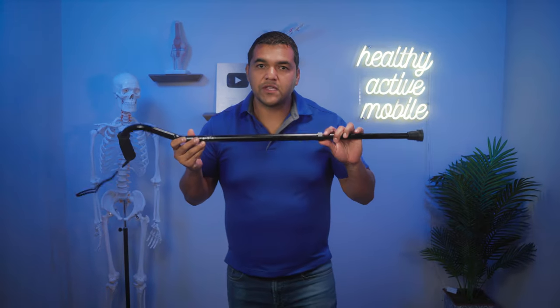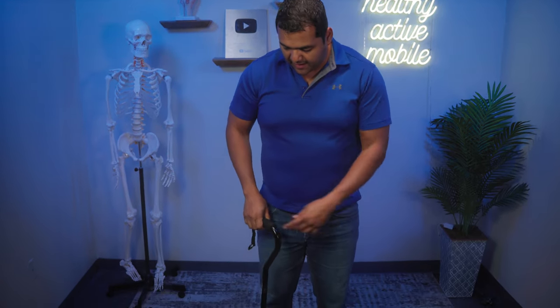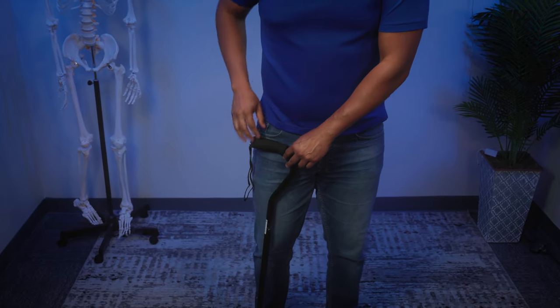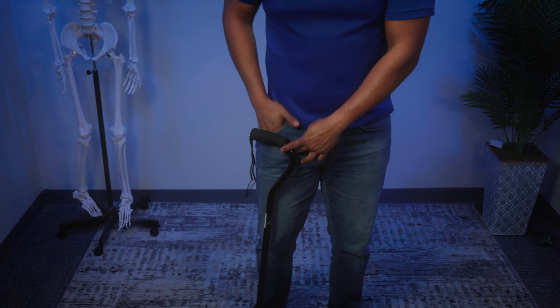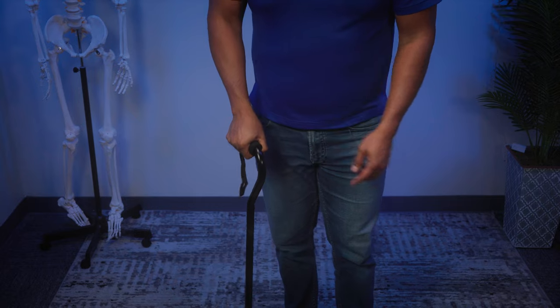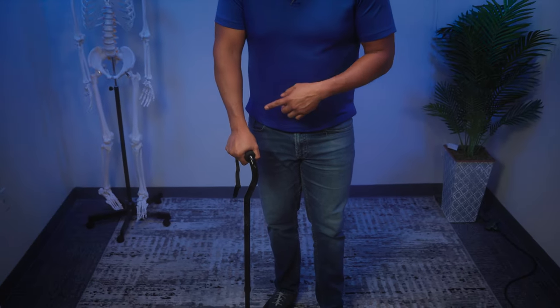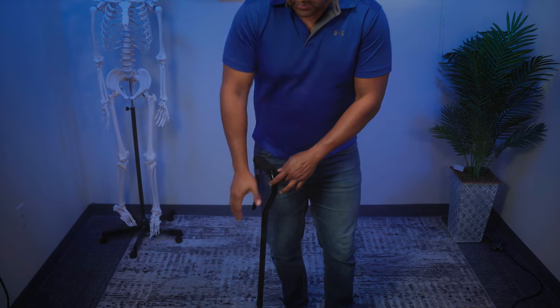Once you're ready to use a cane, the first thing you'll need to do is make sure the height is adjusted properly. When adjusting the cane height, you always want to have that cane about the level of your wrist. Another good measurement point is about where your pocket would be, because once you grab onto the cane you want to have a slight bend in your elbow so that you have some push-off through your elbow.